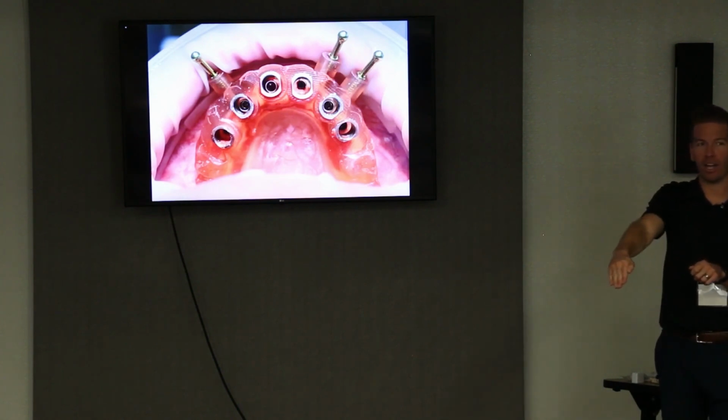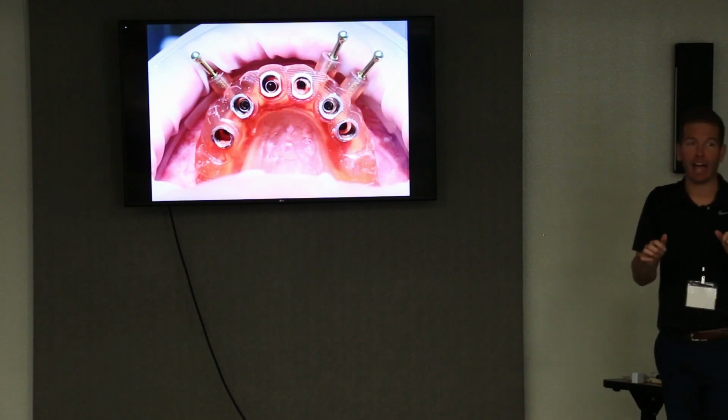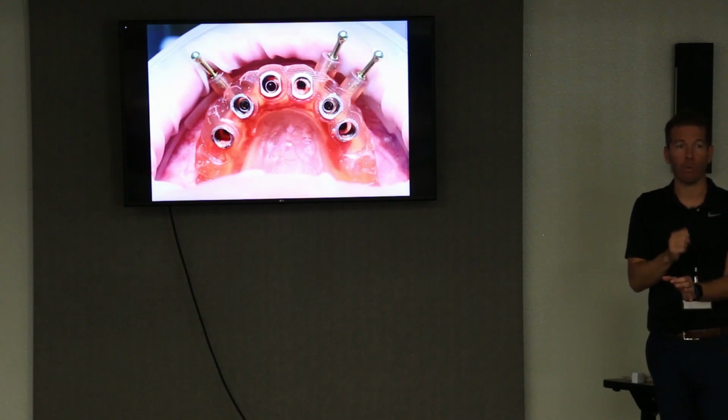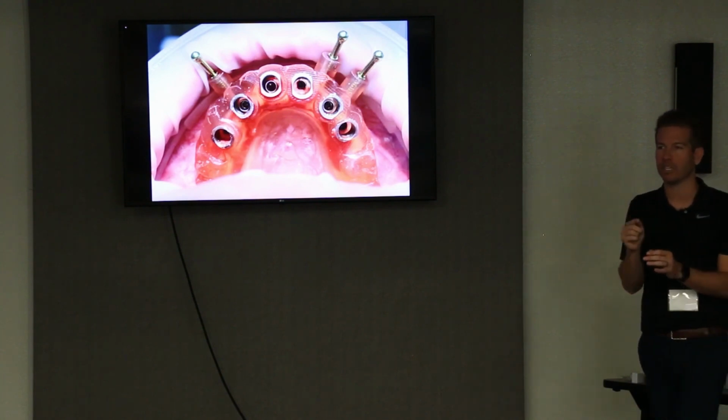I would do a lingual incision all the way across the ridge, okay? And then I would pull the flap back. And then either flatten the ridge or do a starter hole, like a pilot hole with a round burr. Because once you have a started hole, these guides are really accurate, but it's that first drill that you get screwed up on.